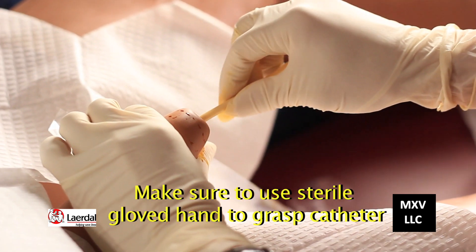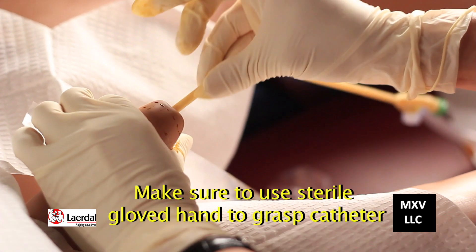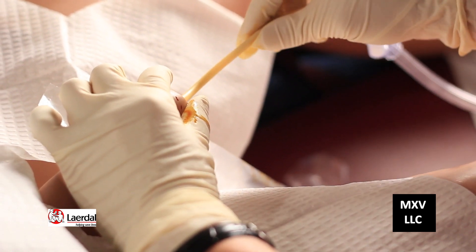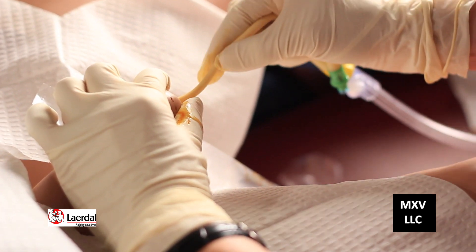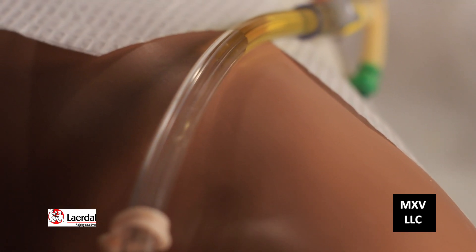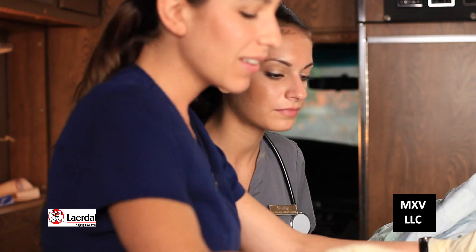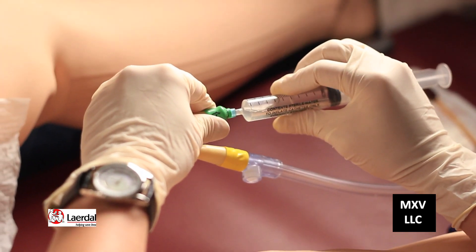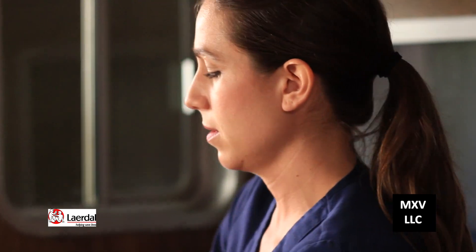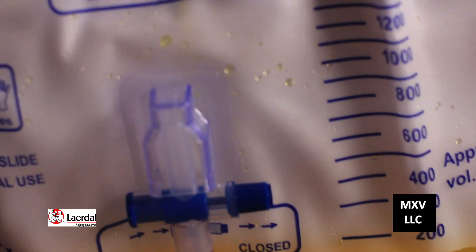Explain to the patient that he might feel a burning sensation and might feel the need to urinate after we insert the catheter. Hold the penis up and gently insert the catheter until one to two inches beyond where the urine is noted to flow — once you see urine flowing, go about one to two more inches. Now go ahead and inflate the balloon so the tube stays in. Take the urinary drainage bag and place it below the patient so the urine can flow. Look at the color of the urine — it's nice and yellow, so there was definitely urinary retention.